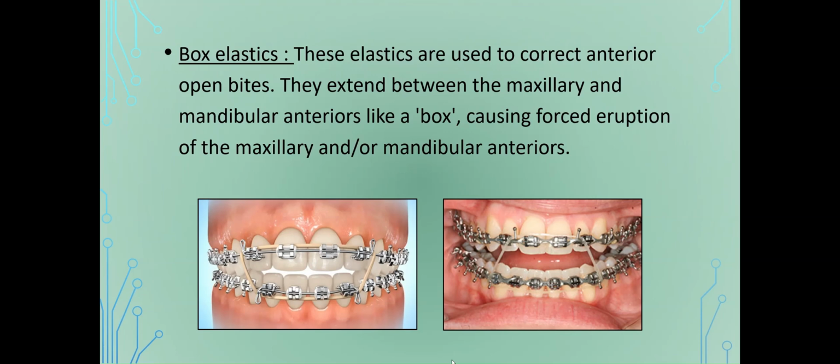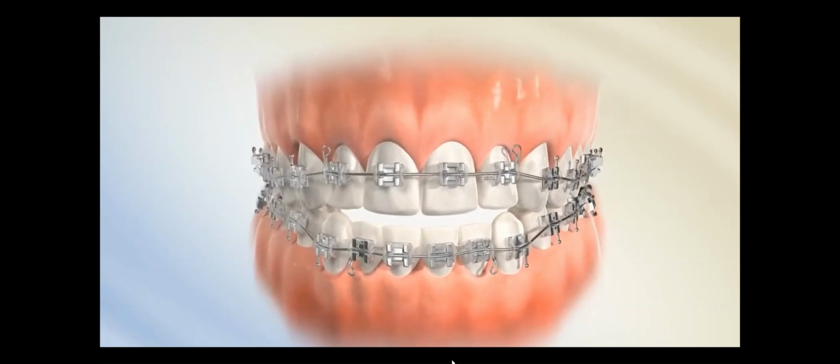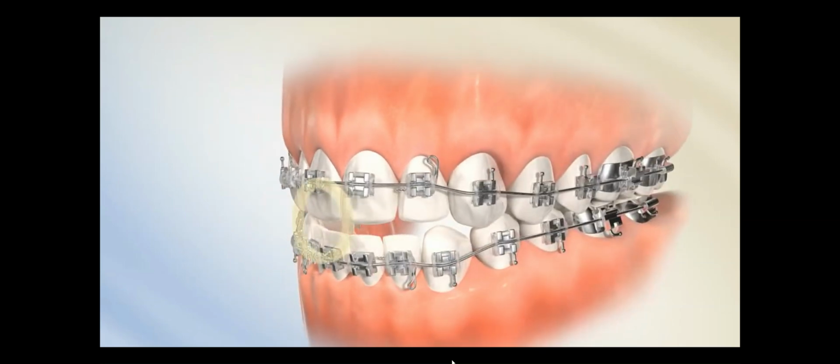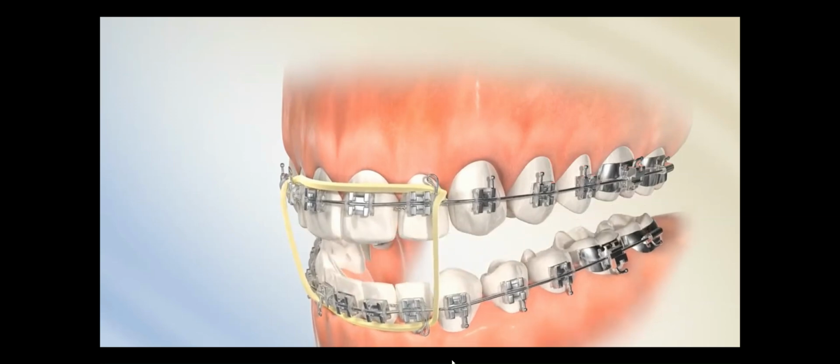Box elastics. These elastics are used to correct anterior open bites. They extend between the maxillary and mandibular anteriors in a box like fashion, causing forced eruption of maxillary and or mandibular anteriors. As you can see, the box elastics are positioned from maxillary right and left laterals to the mandibular right and left laterals, hence causing the correction of open bite.